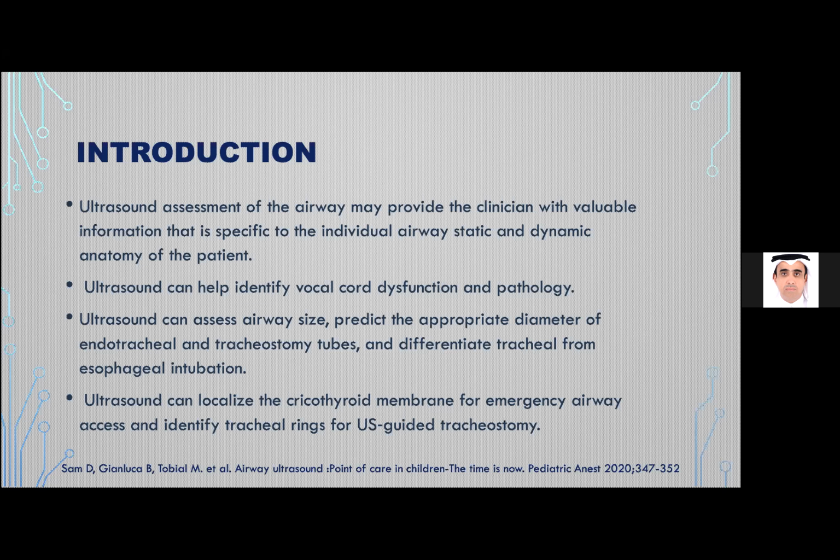Don't misdiagnose the false cord. Sometimes you can see this and label it as the vocal cord. No, this is not the vocal cord, this is the false cord. Sometimes you will be mistaken in mentioning that this is the vocal cord. So how can you differentiate the false cord from the true vocal cord?